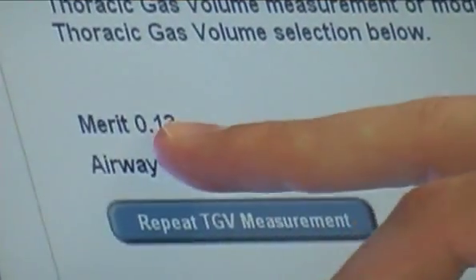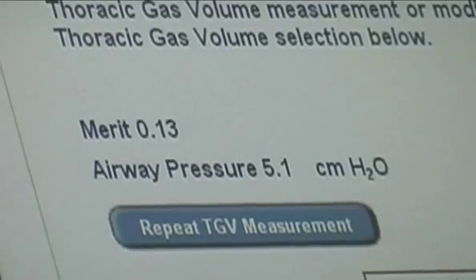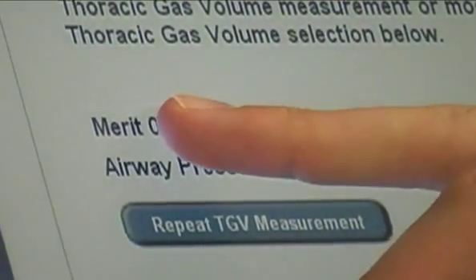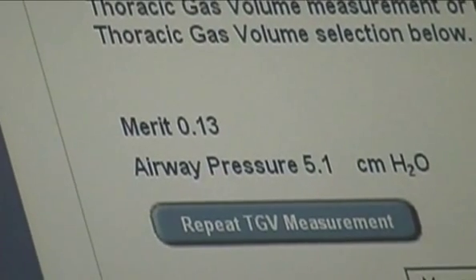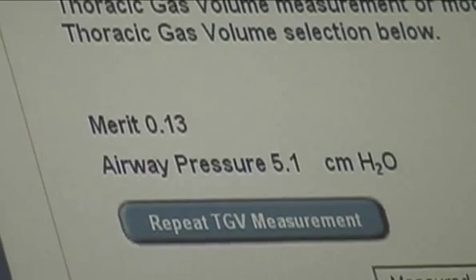okay? Merit has to be under 1. Yep. Merit is the compliance of the maneuver, which she was high, and we were able to identify she was breaking the seal. That's why it was high. Airway pressure needs to be under 35. Why this would be high is someone's huffing too hard. She had that down. Again, I said it before, you can't huff too lightly.